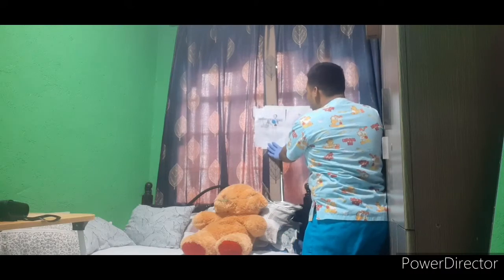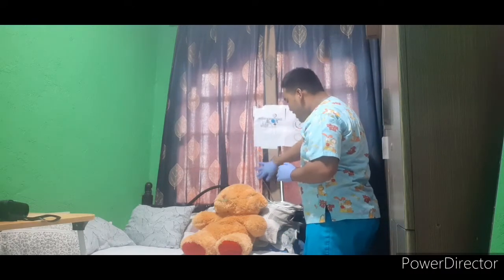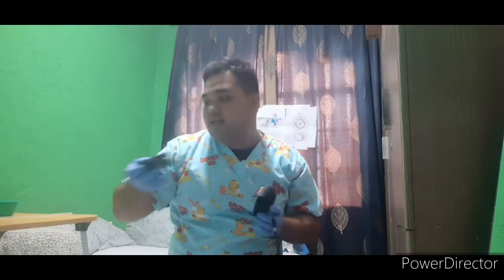After identifying and explaining the procedure to the patient, we have to gather the equipment needed. The equipment includes the suction machine, the pressure gauge, the suction tubing, the nasal cannula of the patient, the pulse oximeter, the catheter, nasal saline solution, a container, and a stethoscope. We will use the stethoscope to check the breathing sound of the patient.